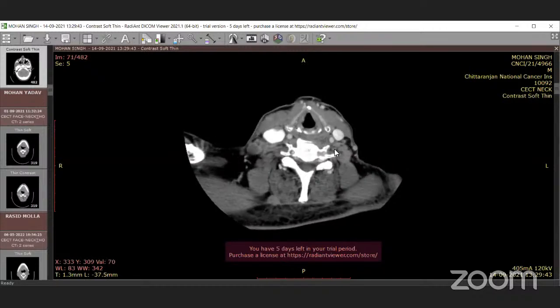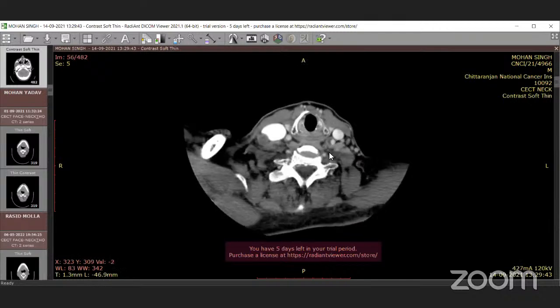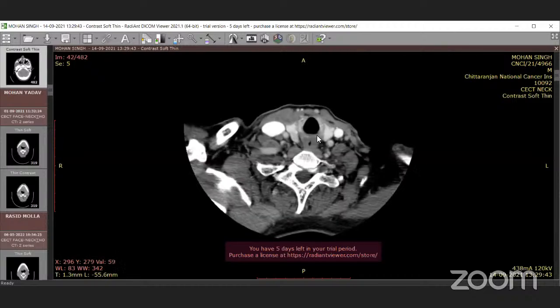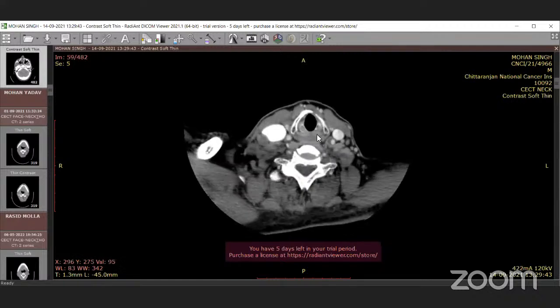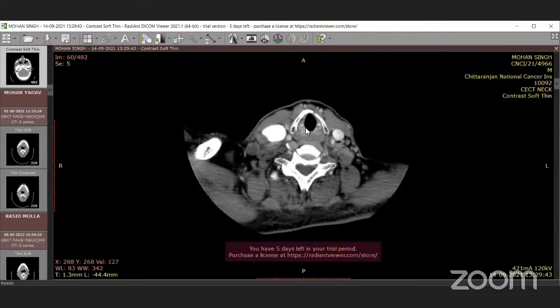Okay. And you have already shown, I guess, the infraglottic space. Is there any specific thing of the infraglottic space? Yes. I think you're asking me about this subglottic ring. Okay. So what happens when we see the cricoid cartilage, when we have already crossed below this muscle, below the level of this muscle, there is no muscle any further.